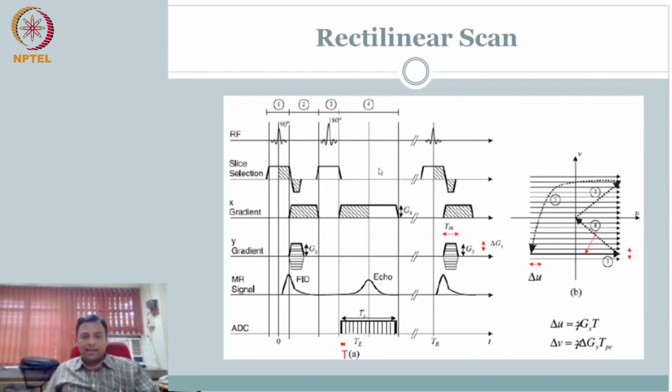The only thing I have added is, remember this was TS before, one box. Now we are actually saying this is ADC, so we are sampling. We are recording the signal that is coming. In this case, it is a spin echo, the echo from spin, so spin echo signal. The signal is recorded over this time, but with some time period capital T.